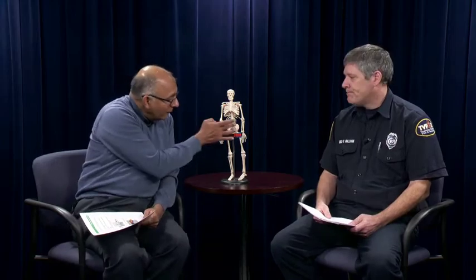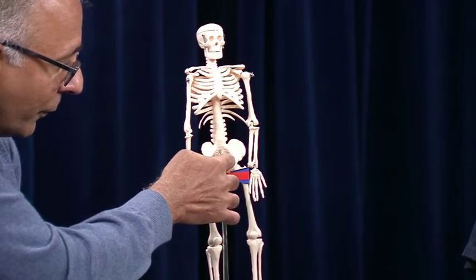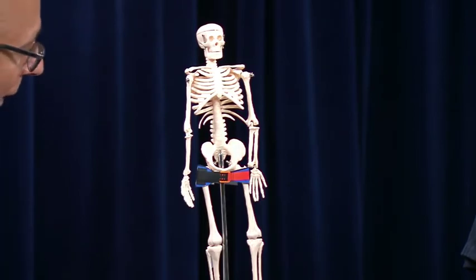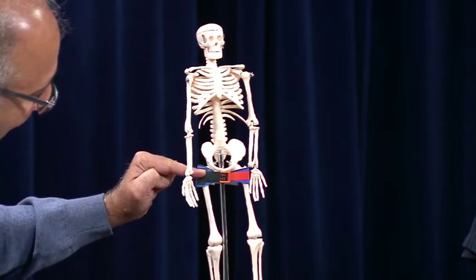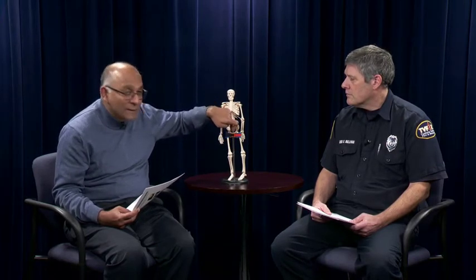Right. So one of the things that we often see is people think that the pelvis is up here. Actually, the pelvis where the vessels are is right down in here, and that's where they're bleeding from. So your typical position is actually going to be over the greater trochanter. So if you imagine the person's wrist at their side, you can see their cuff line actually lines up very nicely with where the greater trochanters are, and that's where the pelvic sling should be positioned. So it's actually not up here, because that actually is not going to help you very much, but it's actually down here. That's where you get the most stability, because most of the bleeding occurs from deep inside the pelvis.